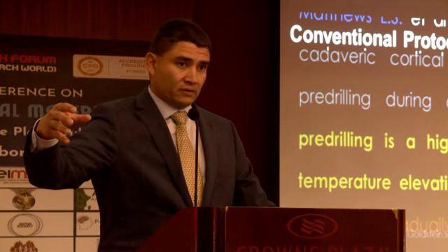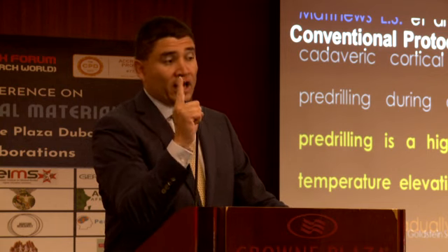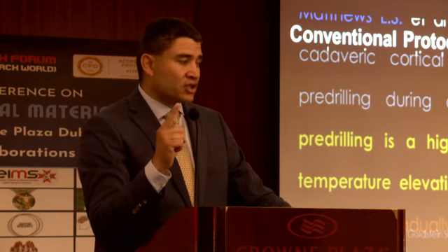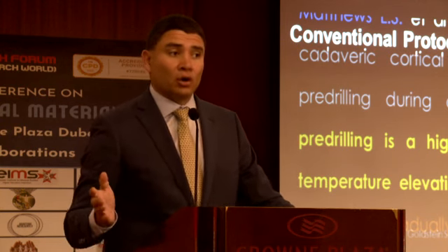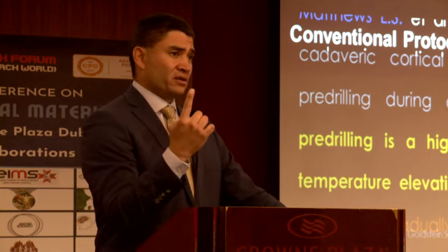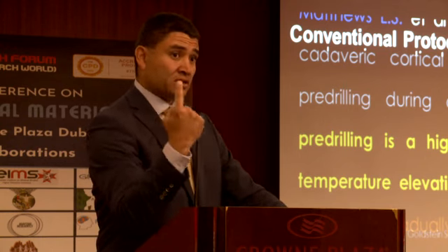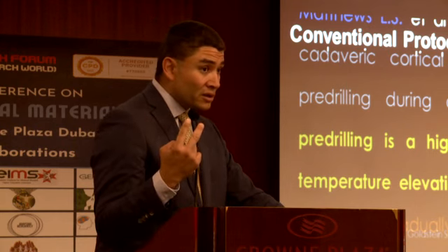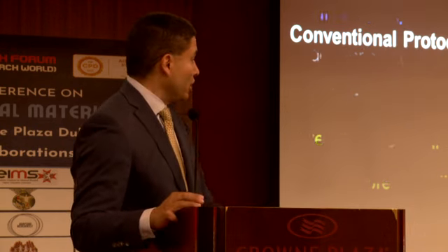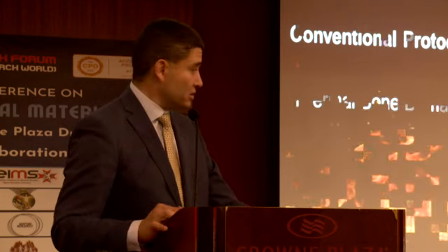It's not true, guys. The damage that originates out of one single drill, the 2 millimeter as a first drill sequence, is the drill that causes the most damage of them all. Well, how much damage does the 2 millimeter twist cause? Does it cause damage just a millimeter around the circumference of the osteotomy? 2 millimeters? 3? Well, we know that the conventional protocol has been repetitive, done generation after generation for the last 50, 60 years.